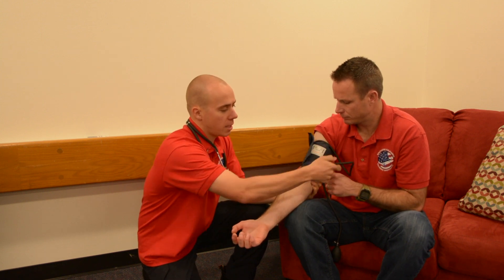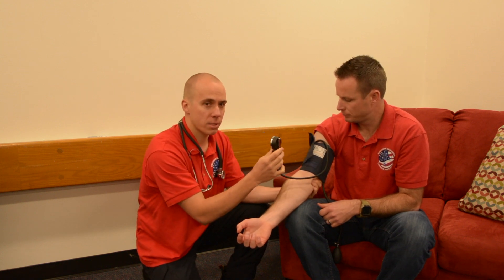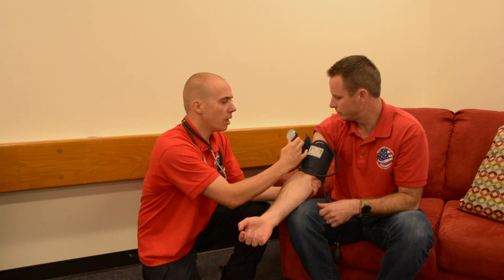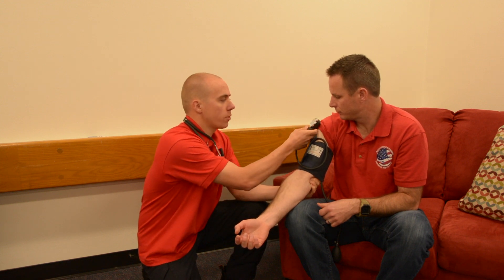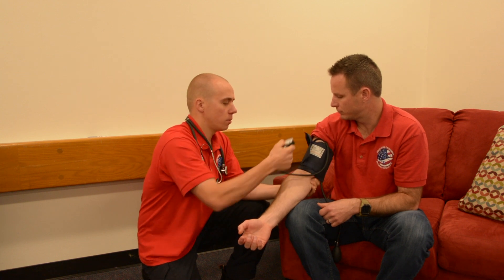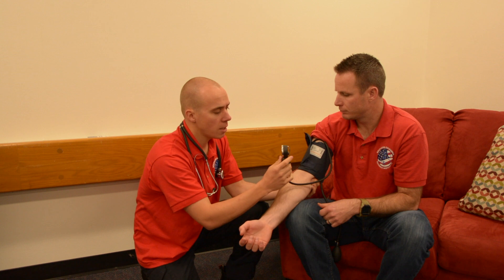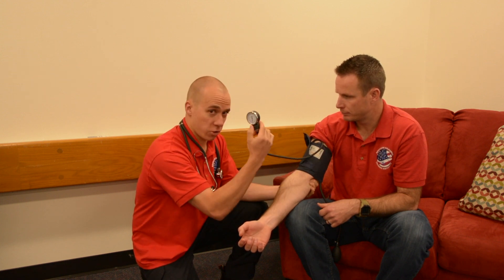When looking at the gauge, sometimes it's hard to see — it might twist, turn, or be out of your line of sight. What you can do is flip the blood pressure cuff backwards and clip the gauge over to the patient's shoulder or somewhere else where you have a better view of it. That's another tip and trick, because you want to make sure you can see the gauge clearly.